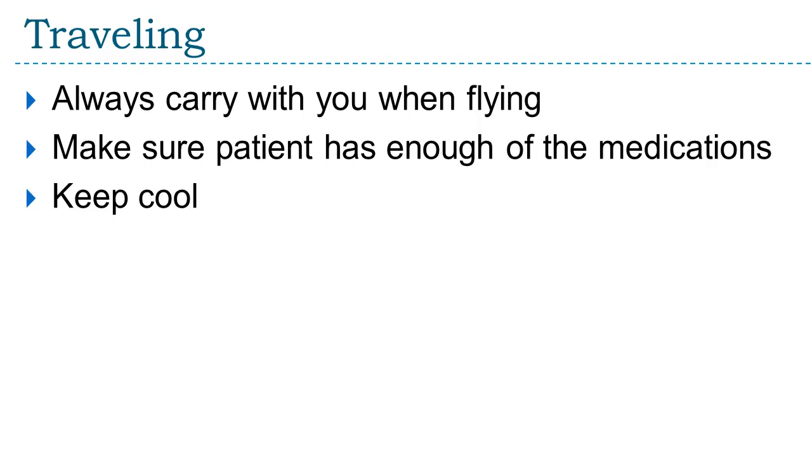There can also be infections at the needle site, so those insertions of needles must be done under very, very aseptic technique. And sometimes it can be an inconvenience to wear pumps. But you can also disconnect it if a person wants to shower, exercise, swim, or even for sex, so that pump will not be in the way, and then there's less chance of it pulling on that needle and dislodging that needle.